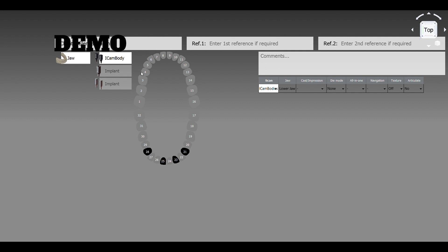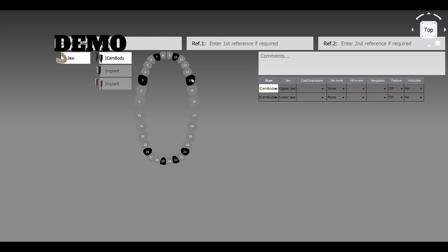And then on the upper we have 3, 7, 10, 14, okay? So once we do that, then we do mandible first, so when it does it, now it's going to automatically take us into the calibration.